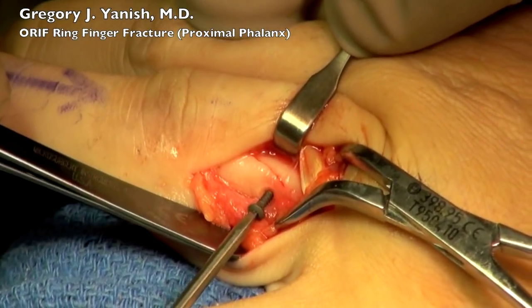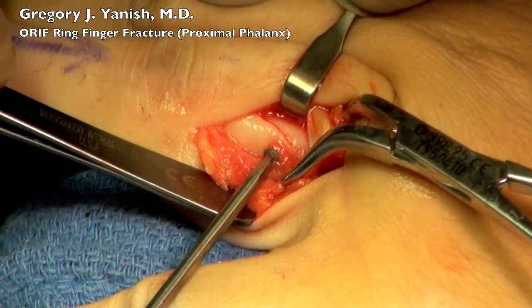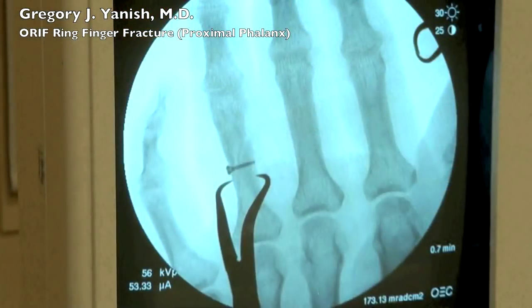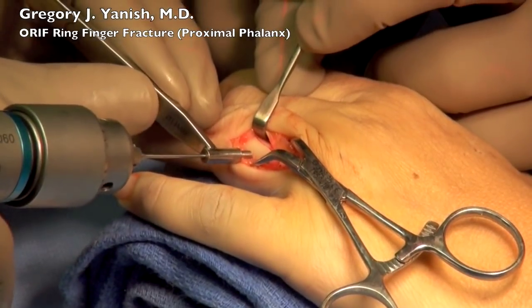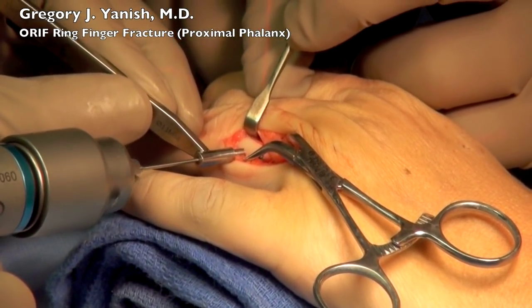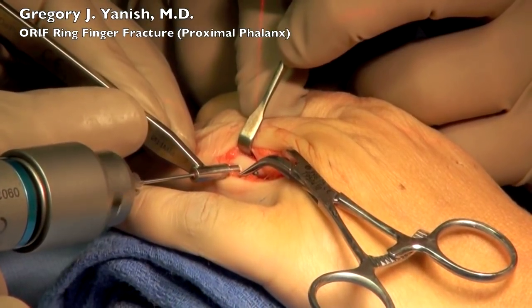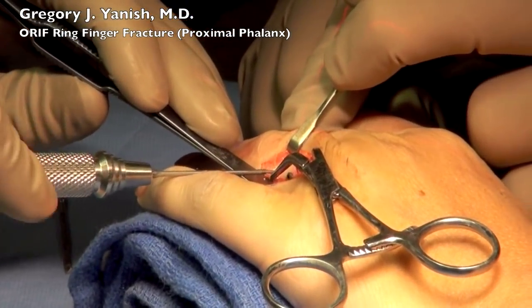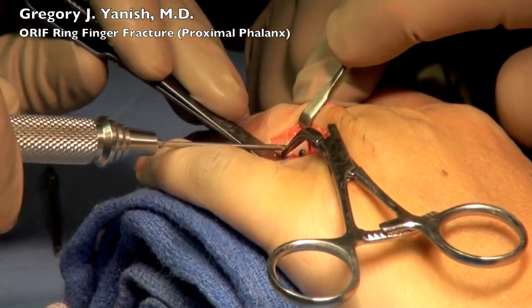The depth gauge is then removed carefully so as not to disrupt the fracture. This hole has already been countersunk with a separate drill bit. The screw goes in, properly measured, and seats nicely pulling the fracture together well. In proper lag technique this screw is only biting into the distal cortex — the wall of the bone furthest away from the head of the screw. One screw is seated nicely and we'll drill the hole for the second screw. This is the smaller of the two drill bits which will go through and through the entire bone, followed by the secondary drill bit for the lag screw, which is slightly larger and is only going across the proximal cortex.